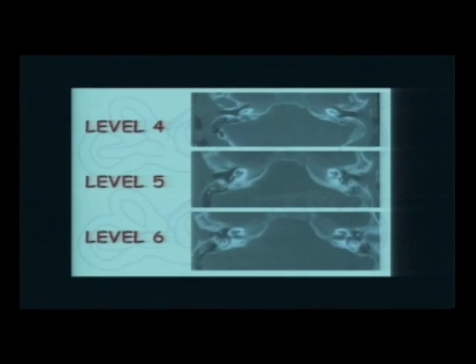This is my hand here. And then the canal goes all the way up to unite with the superior canal. It's quite a large canal. So if you take a horizontal cut here, it's going to appear as the ampullary end and the canal itself. If you take a higher cut, it's going to appear as a cross section in the canal. And with a still higher cut, you're going to see it joining the superior canal. Same way as the cochlea, you take several levels, and it's quite a big structure. So if you look here, this is the posterior semicircular canal.